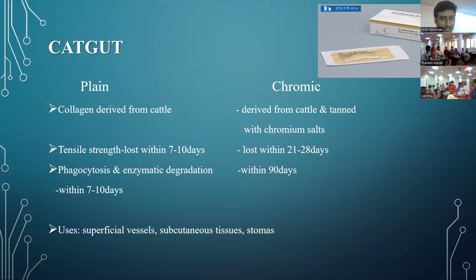Okay, accepted. So basically, terminal cases. Anything else? Oral cavity. Next, circumcision. Because you don't expect to go and remove sutures, and you don't want it to stay there for a long period of time. You can use it.